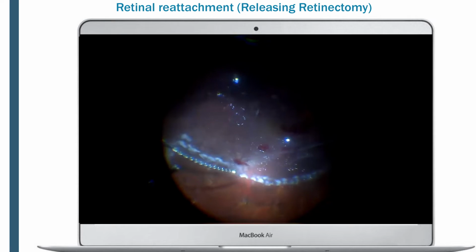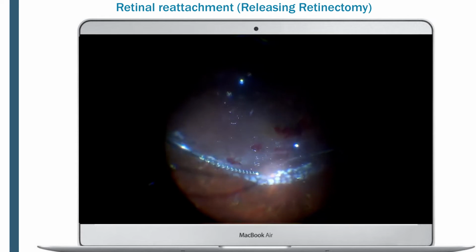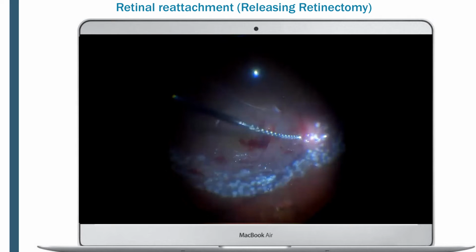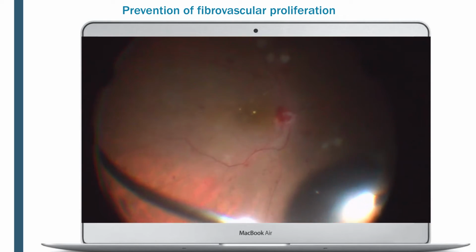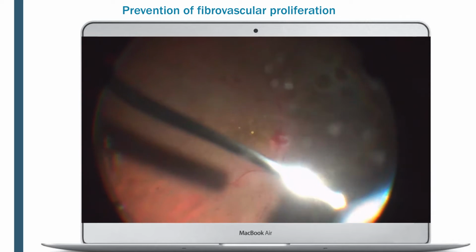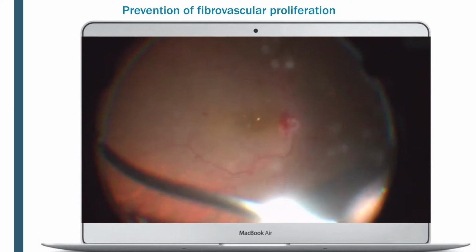As in all surgeries, diabetic surgery includes a lot of complications, but the most common are bleeding, iatrogenic breaks, and sclerotomy-associated complications. Obeying the rules in diabetic vitrectomy and applying all the steps one by one can prevent any complications. My take-home message: before you focus on the problem at the central pole, you have to prepare the peripheral retina to allow you to solve the problem at the center.